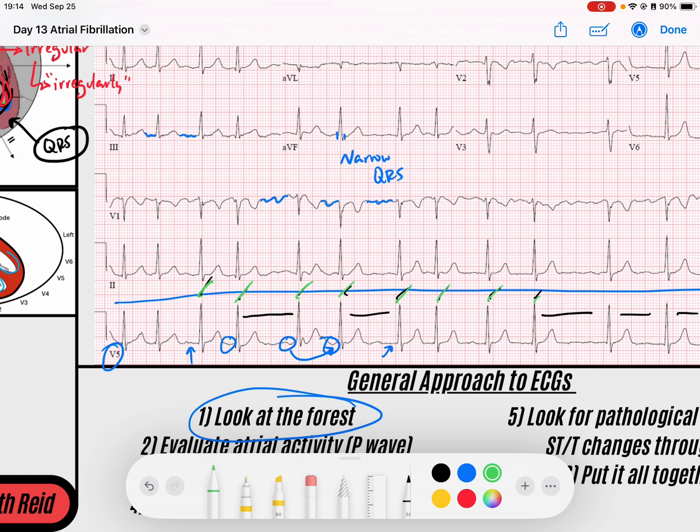We would see a P wave. In the setting of a rhythm that is irregular, there's no regularity to how irregular it is, meaning that I can't identify a pattern like an AV block. This tells me narrow QRS, irregular irregular rhythm, this is atrial fibrillation.